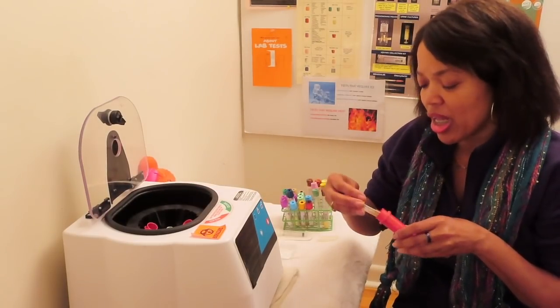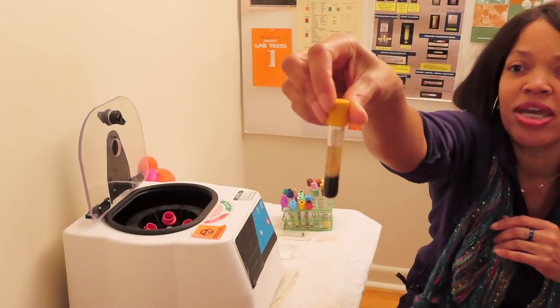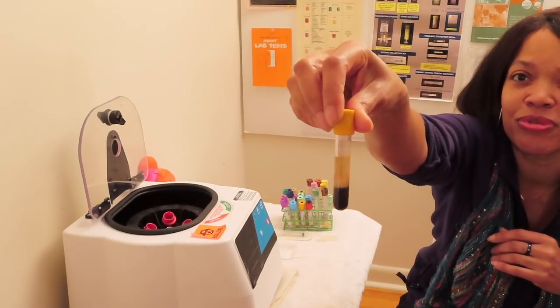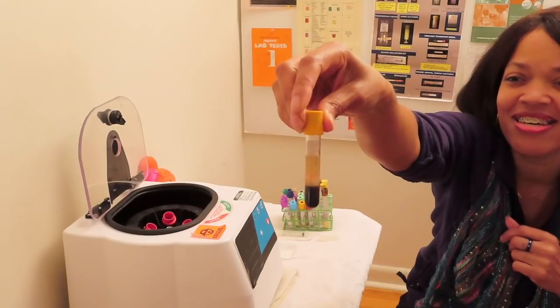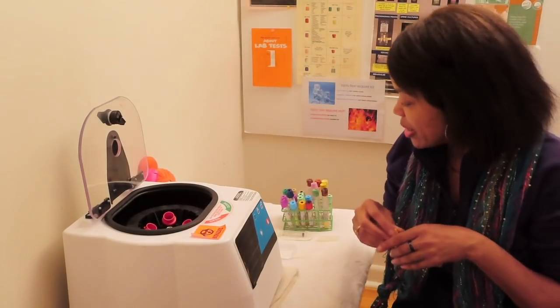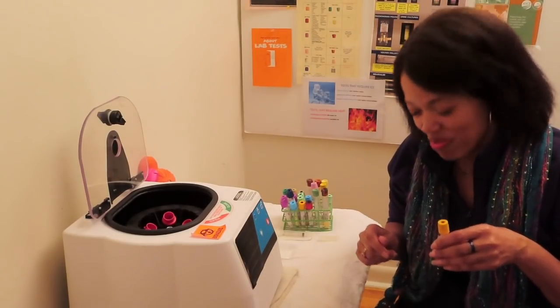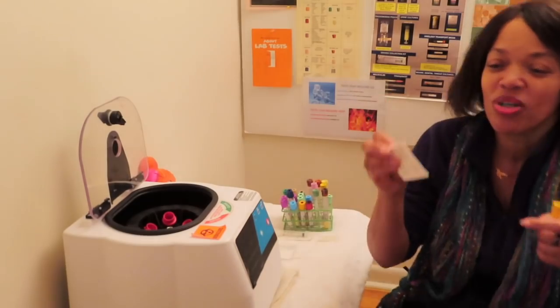So we did let our blood clot. And we spun it. And this is what we have. We have clear, beautiful serum. Got that? You see that? Yes. So now just pretend for the sake of pretending that I am in. You know what I forgot to do? I forgot to label the tube. Okay.